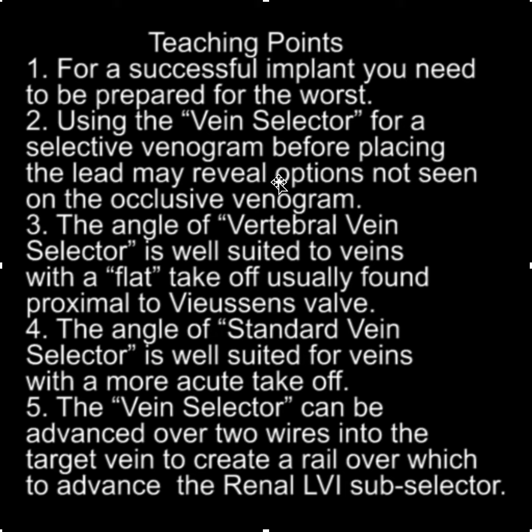Using the vein selector for a selective venogram before placing the lead may reveal options not seen on the occlusive venogram. The angle of the vertebral vein selector is well suited for veins with a flat takeoff, which are usually found proximal to Vieussens valve. The standard vein selector is well suited for veins with a more acute takeoff. Finally, the vein selector can be advanced over two wires into the target vein to create a rail over which to advance the renal LVI sub-selector.